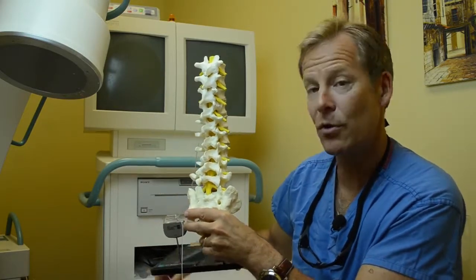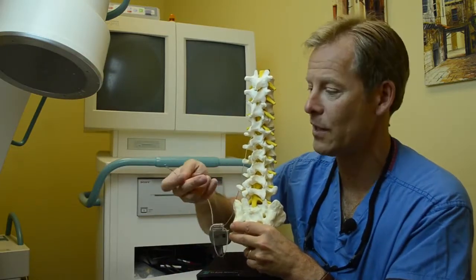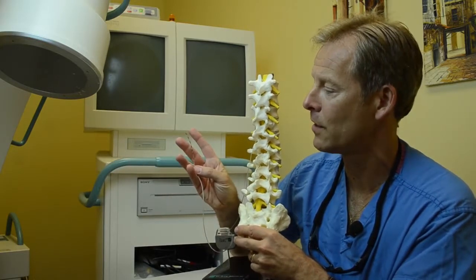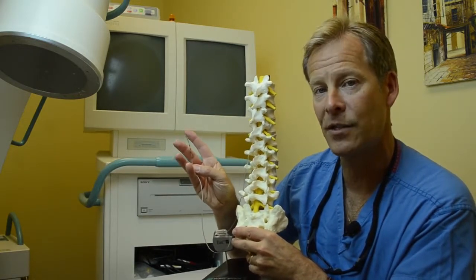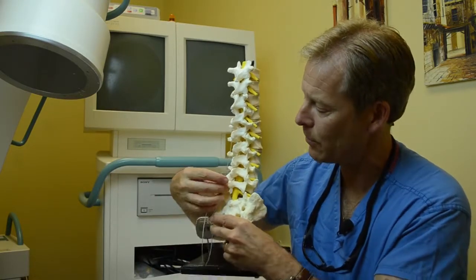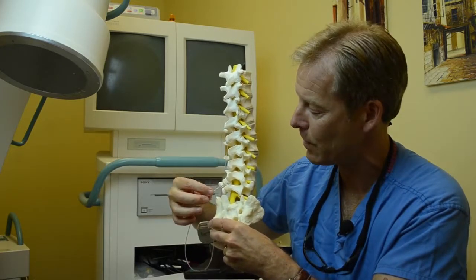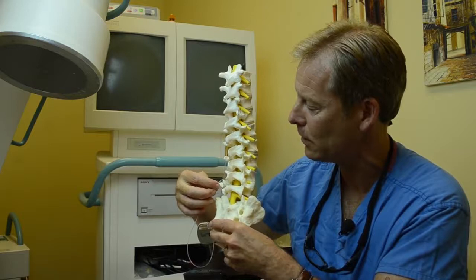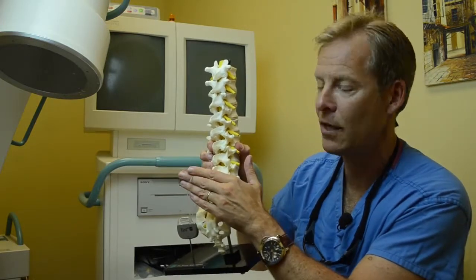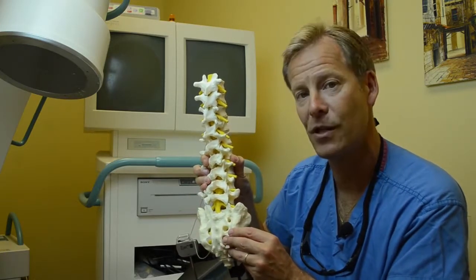Once the epidural space is identified, we take this lead — essentially a piece of spaghetti that has little metal contacts on it. Metal contacts conduct electricity. The leads are introduced through the needle and up through the epidural space, just like an epidural catheter for OB. Once the lead is placed, it comes outside the skin and you go home with this for about a week to make sure you're a great candidate for this particular procedure.